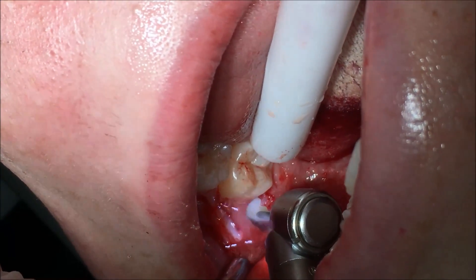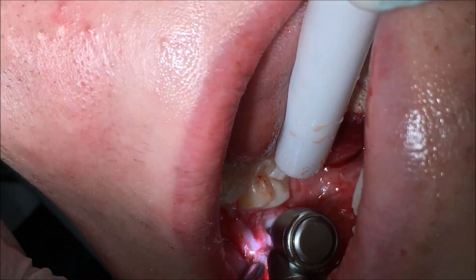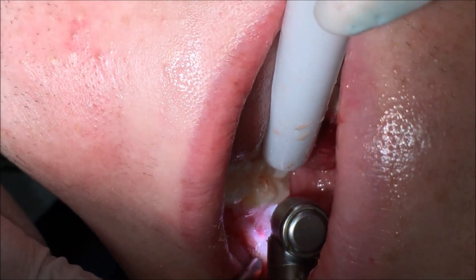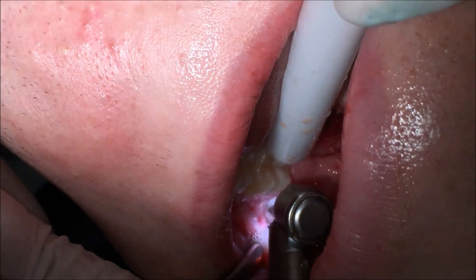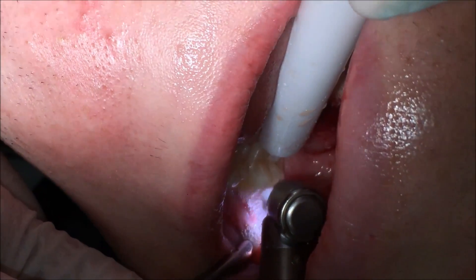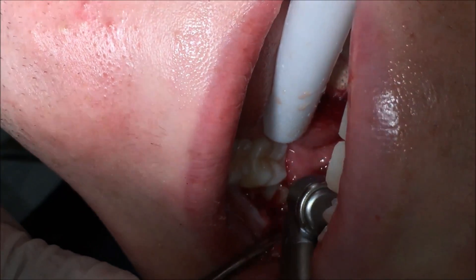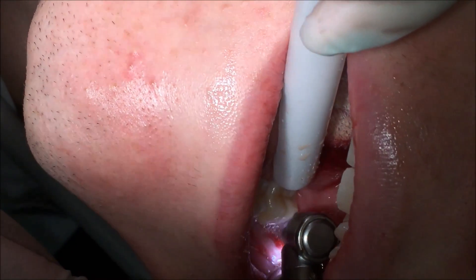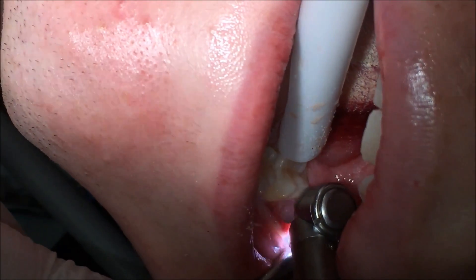Now I'm going to begin the section. I'm using the 45-degree head handpiece, basically starting the section down near where I think the furcation is, doing a depth cut almost to that furcation, and then moving across slowly. Because of the conservative nature of my flap, I really use the angulation of this handpiece to ensure that the soft tissue doesn't get caught. I'm basically pivoting around an angle and at all times my burr is fairly well visible. With this handpiece and a brand new burr, this section doesn't actually take too long at all — it's almost like a hot knife through butter the way it can cut tooth. I've just got a long shank diamond burr on this NSK 45-degree head handpiece.